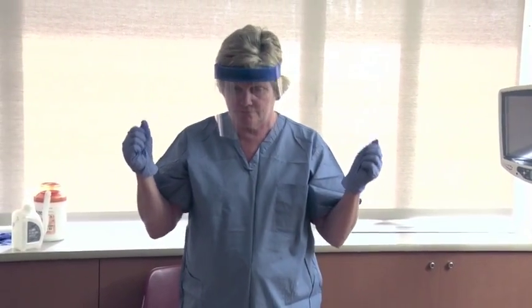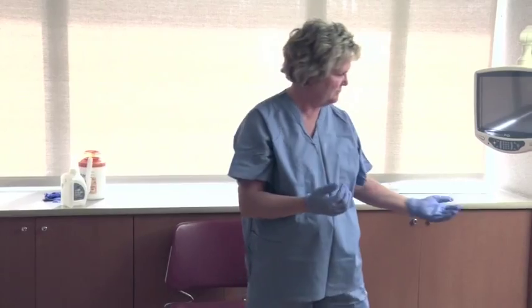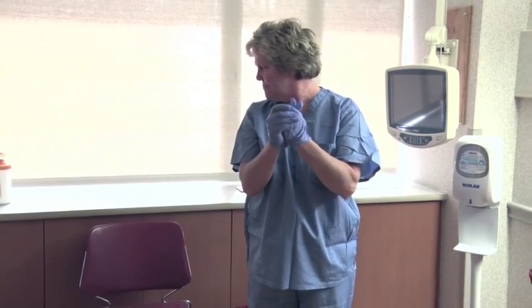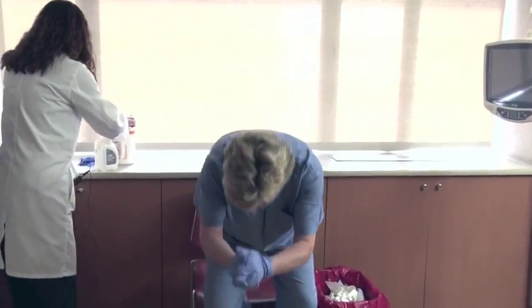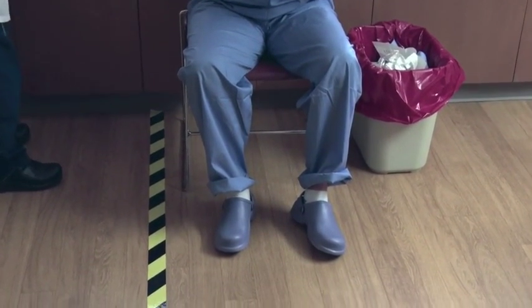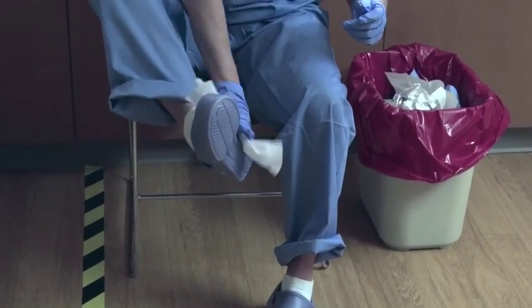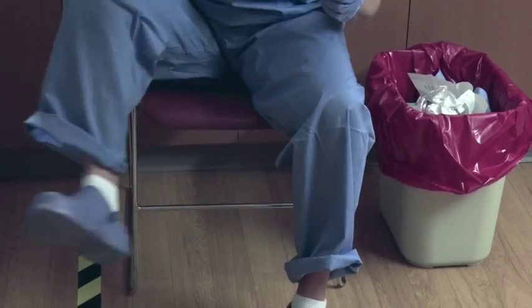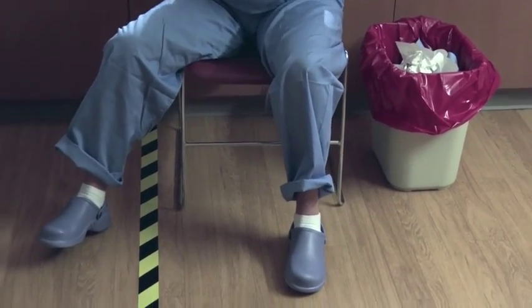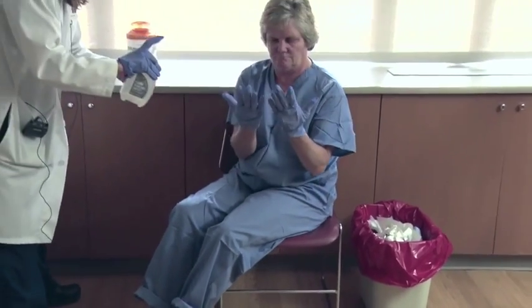Remove the face shield by tilting the head forward, grabbing the sides of the elastic band near the temple area, and slipping the strap off the head. Inspect and disinfect inner gloves. Disinfect all surfaces of your hospital washable shoes by sitting down in a clean chair and wiping them with a cloth with bleach. Wipe from top to bottom, cleaning the soles of the shoe last. Inspect and disinfect inner gloves.